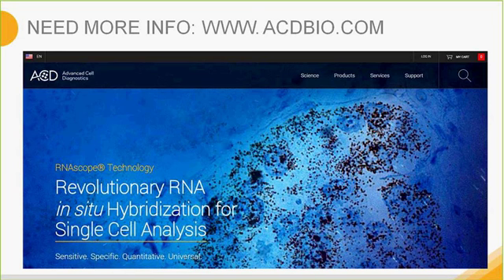Another question is elaborating on the steamer protocol. So the steamer protocol is essentially using an electric steamer that for RNAscope 2.5, we have validated our assay on the Oster steamer that could be purchased externally. This essentially works as well as a food steamer in the sense that the target retrieval solution is actually being steamed via the electric steamer. For more information about the steamer protocol, please consult our sample prep user guides for 2.5 that are on the web.